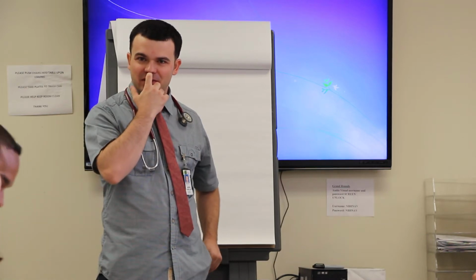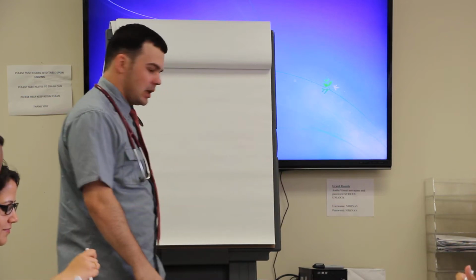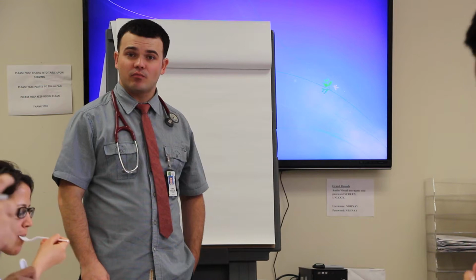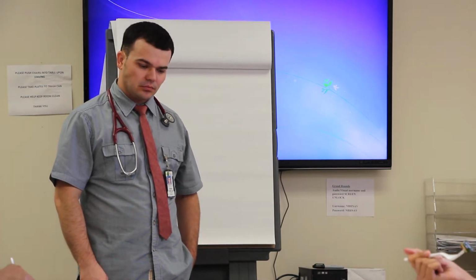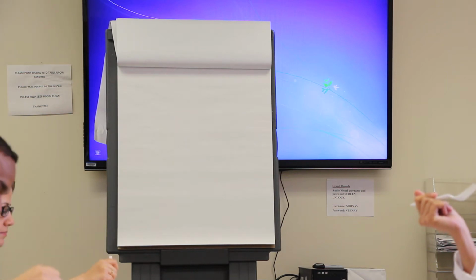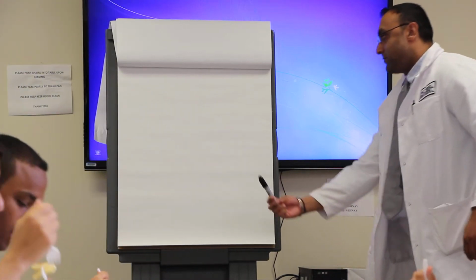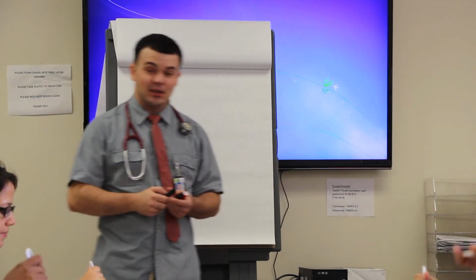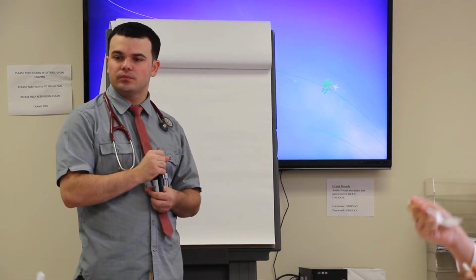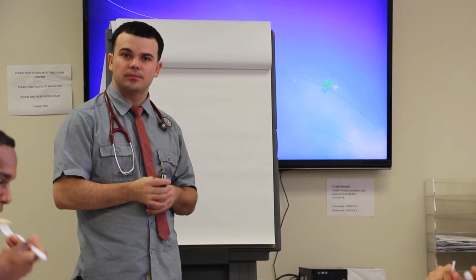All right, so everybody's familiar with me by now, right? Dr. Karish. So we're going to do a review of the EKG today, okay? So what's the first thing you read on EKG? What should you be looking at?